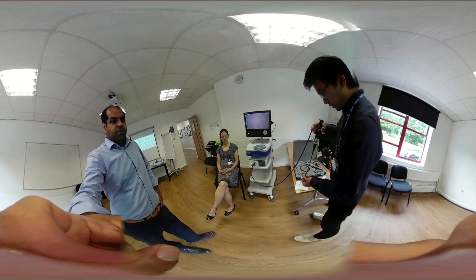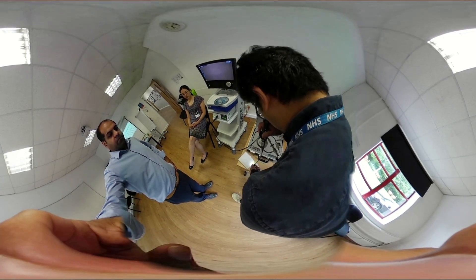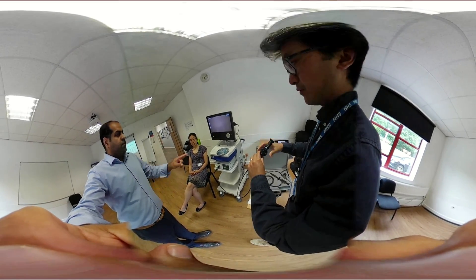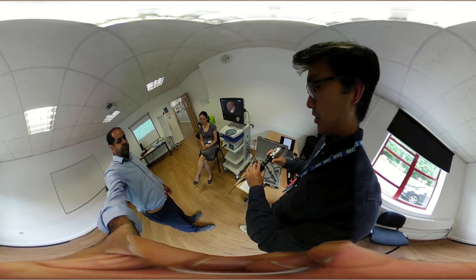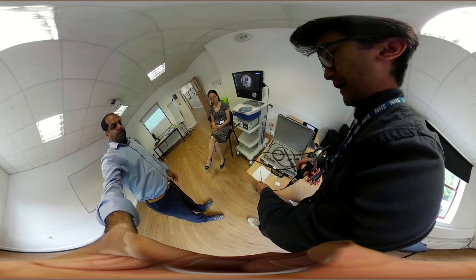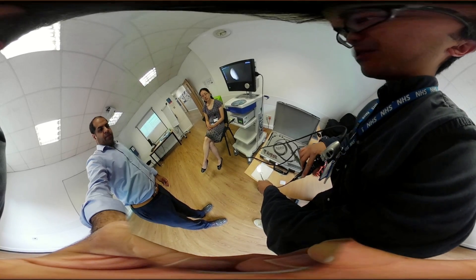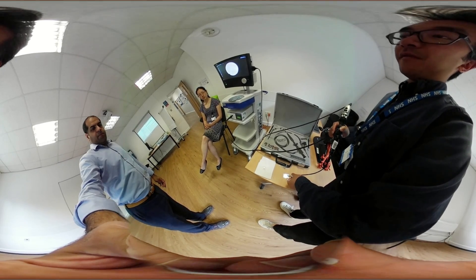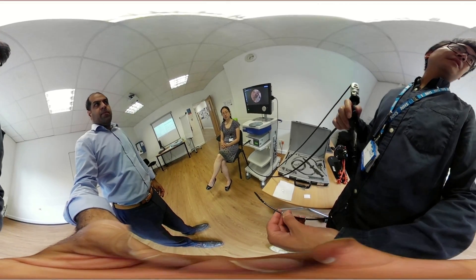Now that you've got good illumination, have a look through the camera. We usually use the packet on the jelly tube to make sure you're getting a clear image and can read the writing. If it's out of focus, you can adjust the diopter to suit your own vision. Once you know the camera is in focus and there's good illumination, you need to lubricate the tip of the camera. Put the tip — but not the actual lens itself — into the lubricant jelly and roll it slightly to cover the entire circumference. Then use the alcohol stirrette to rub the lens directly to de-mist it. Another way to de-mist it is to ask the patient to stick their tongue out and rub it on a bit of saliva. Now you're ready to do the scope.